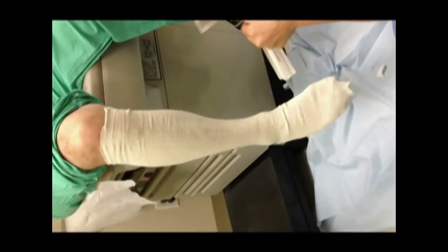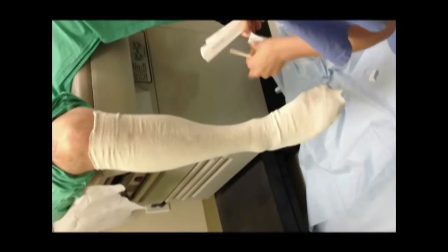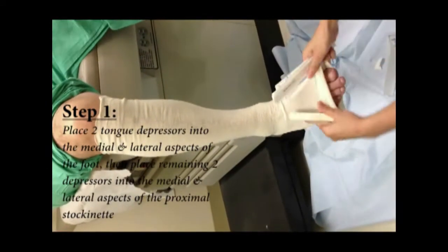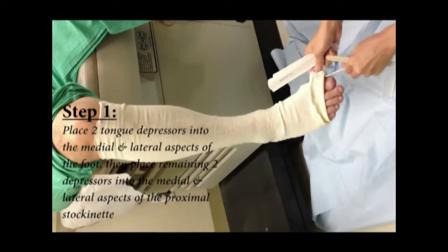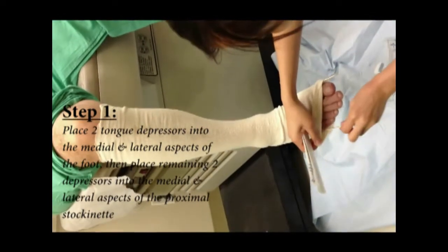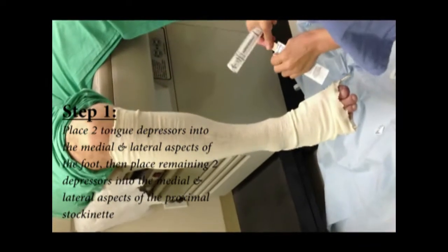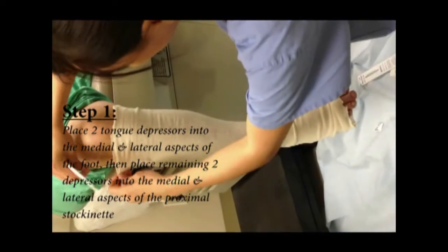We'll put the tongue depressors in the medial and lateral side of the foot, like so. And then one at the top.